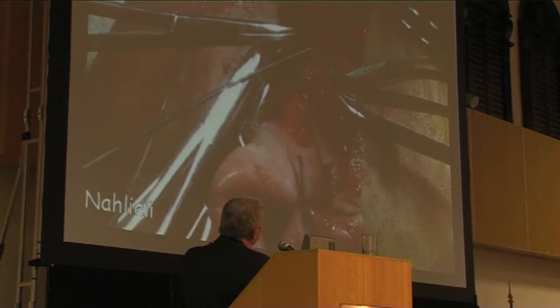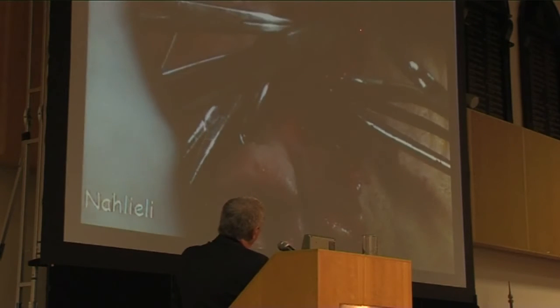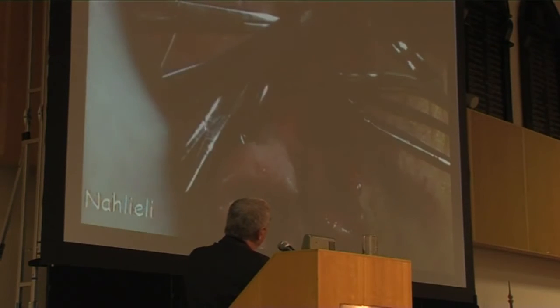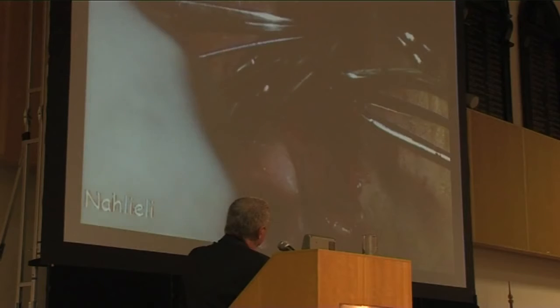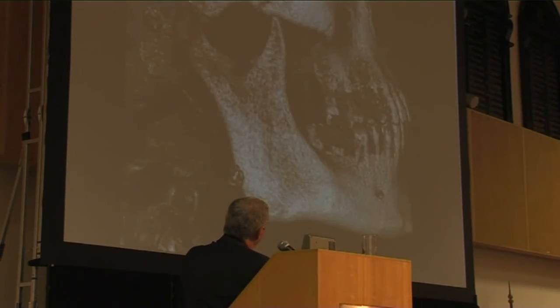And we remove 2 stones from the anterior part of the duct. And this is the result. Another case, a stone in intraparenchymal.